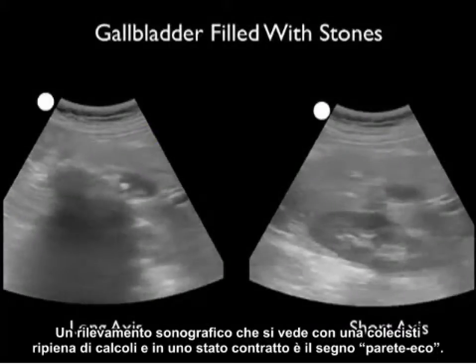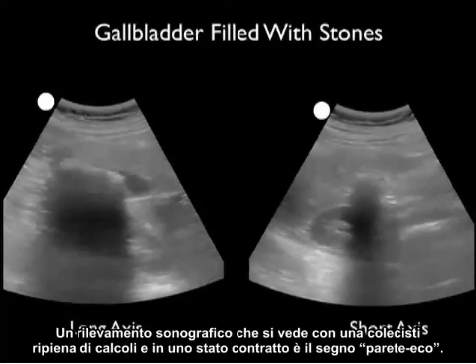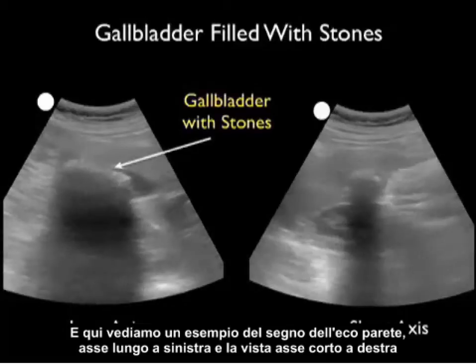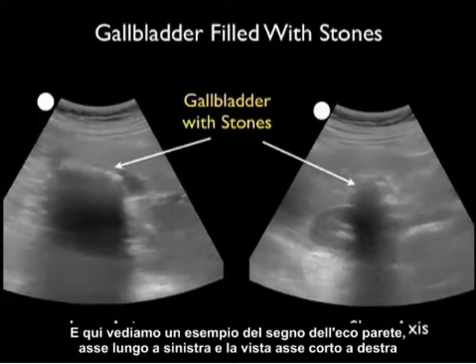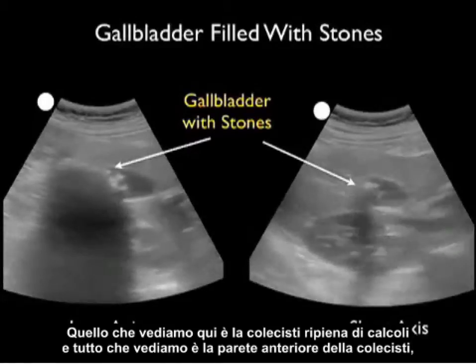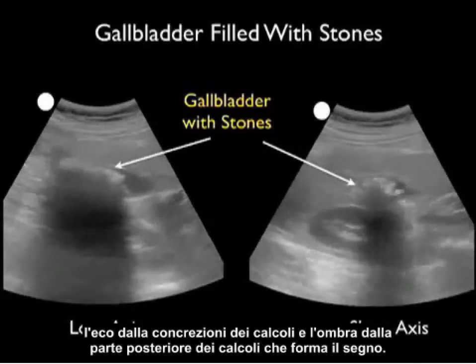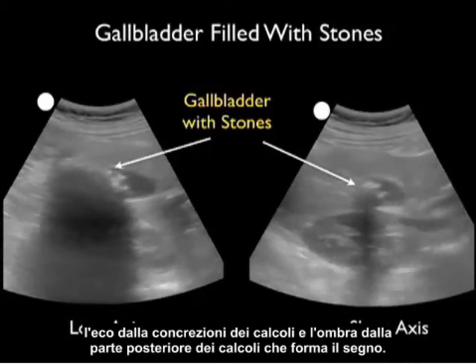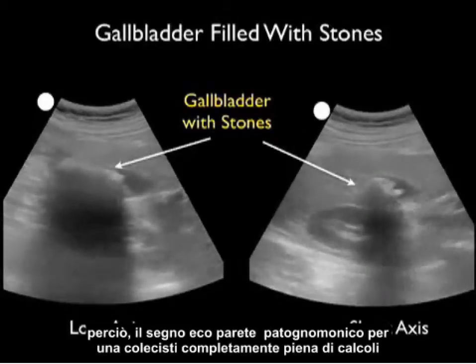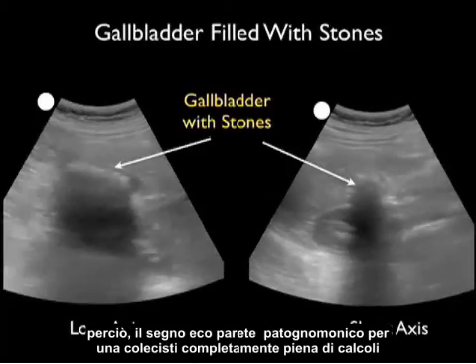A sonographic finding seen when a gallbladder is completely filled with stones in a contracted state is the wall echo sign. We see an example here in both long axis and short axis views. What we see is the anterior wall of the gallbladder, the echo from the concretion of stones, and the shadow off the back of the stones making the sign. The wall echo sign is pathognomonic for a gallbladder completely packed with stones in a contracted state, and it can be occasionally difficult to find the gallbladder when this is all you see.